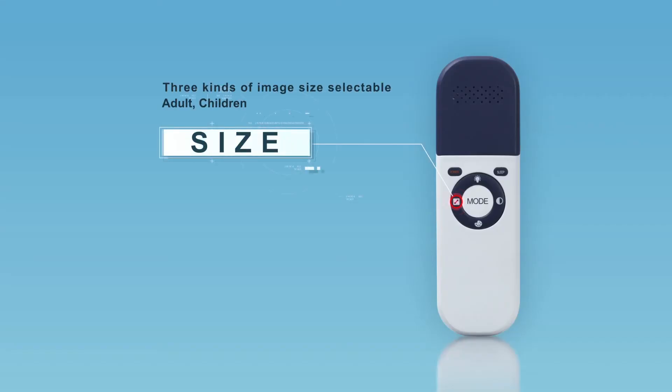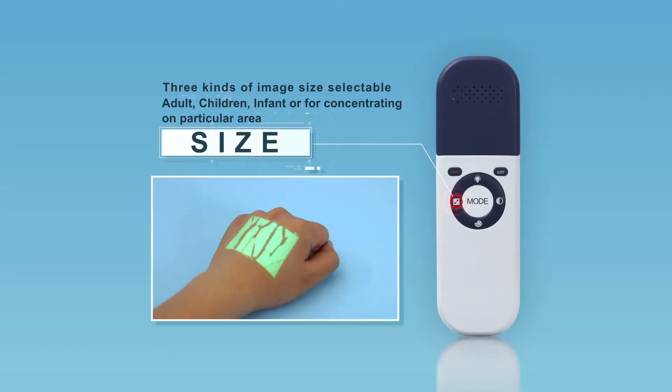Three kinds of image size are available to suit adults, children, and infants, and are also helpful when medical staff need to constrain the view to a particular area. You can change the size by short-pressing the Size button.